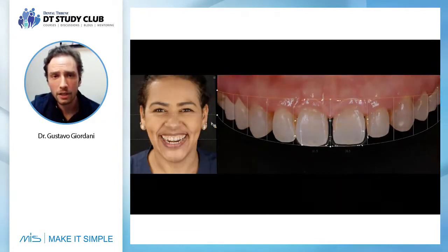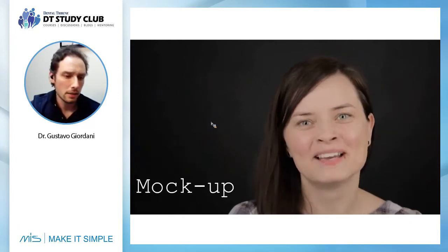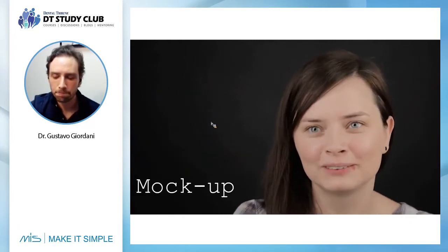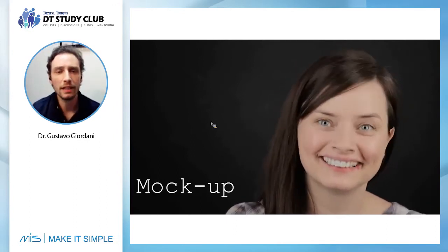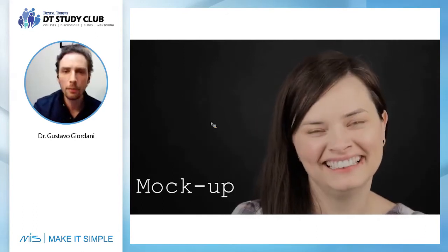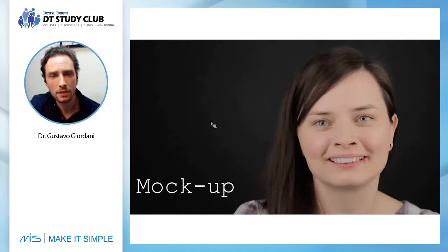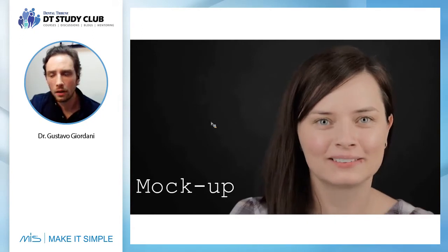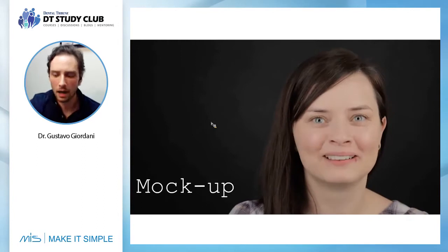So this is very nice. We are using it a lot in our patients and it's working very well. It's available, you just go to smilecloud.com, and this is a really nice thing to do. So it's what we did in Monica's case. We did the mockup using SmileCloud. We printed the model, we did the mockup, and then Monica said yes to our shapes, and we decided to move on and decide the implant position according to this mockup.